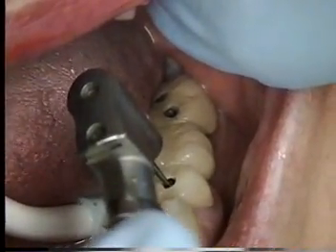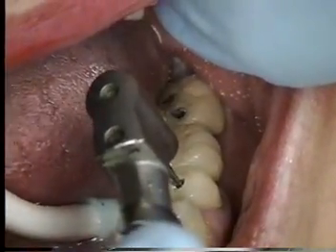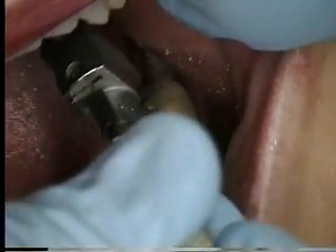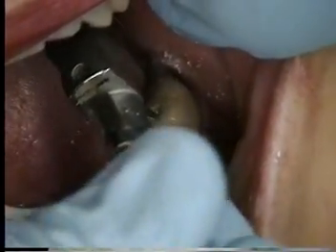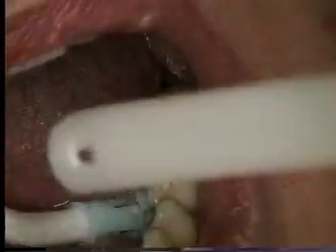The first four or five threads on the metal lift instrument are actually tapered. So I need to go down at least about a half a millimeter below the metal so that my metal lift instrument will catch the metal properly.